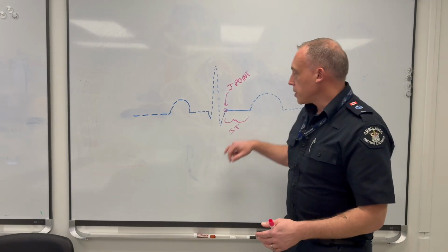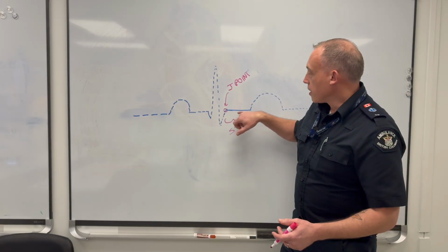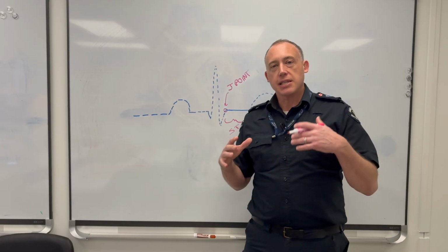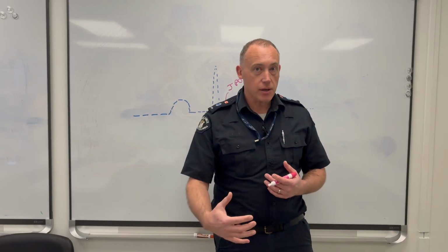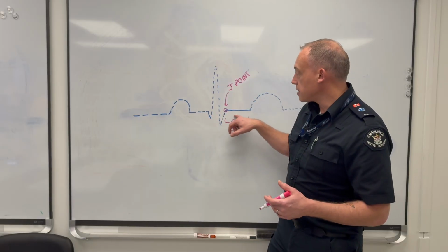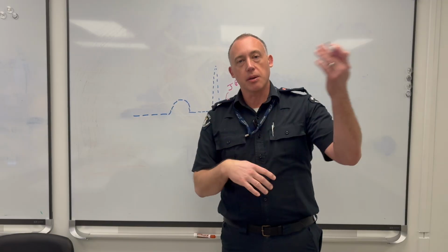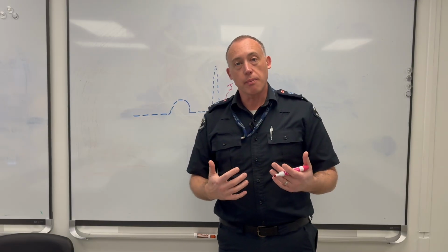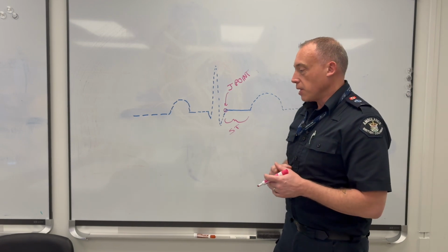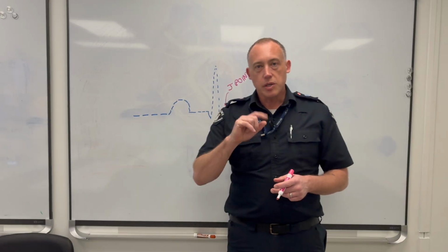The best way to think about the ST segment is this is making the ventricles fire. This is the ventricles actually moving. So this is where we actually relate that electrical stuff into the mechanical stuff. We have the electrical depolarization, and then we have this time here, and in that time is when the ventricles are actually squeezing and propelling blood forward. So that's a really important part of the cycle, obviously, because you have to have time to actually move the blood. And once that's over, then we get into the T wave, which we'll talk about next.